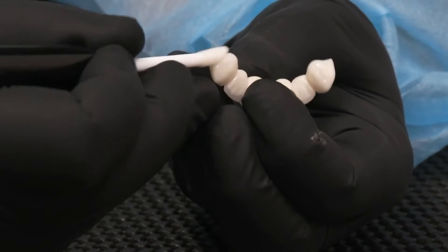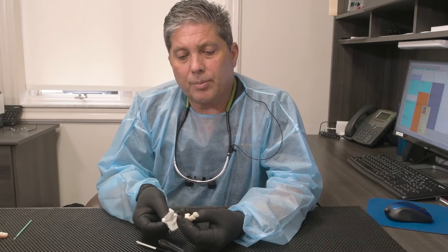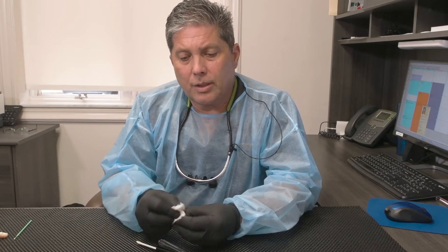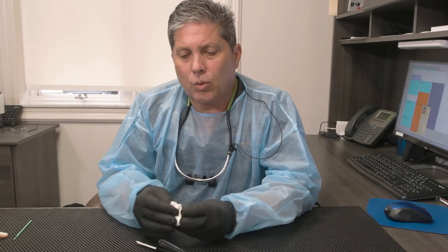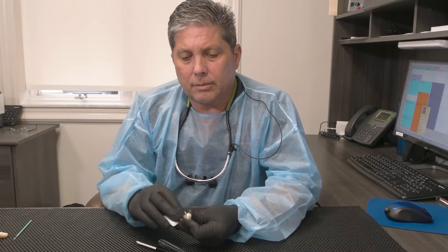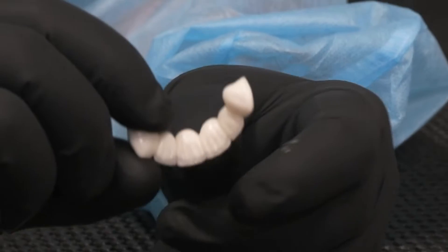Do not place any inside the prep areas, but go ahead and cover the pontic side. Now once you've completed the application, a very critical step in the process is to take a gauze and just wipe it off — aggressively wipe it off. The optimum thickness is one micron. Once you do that, you've coated the bridge perfectly.